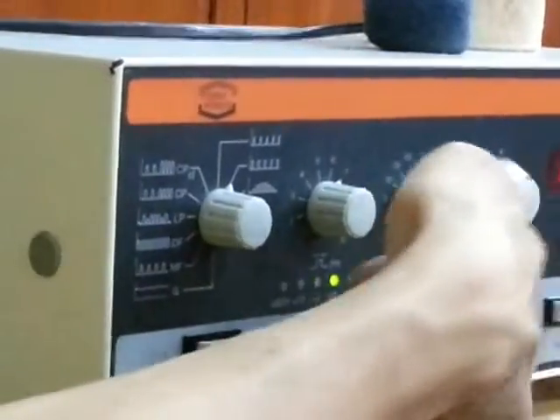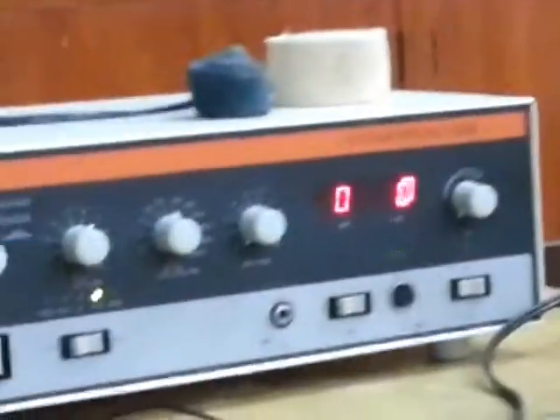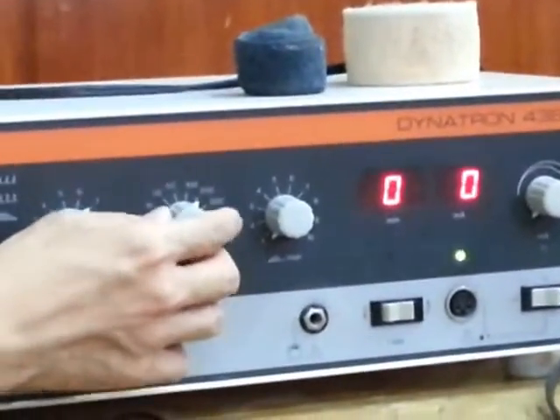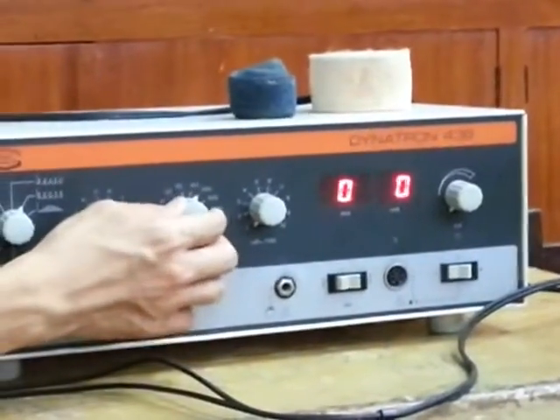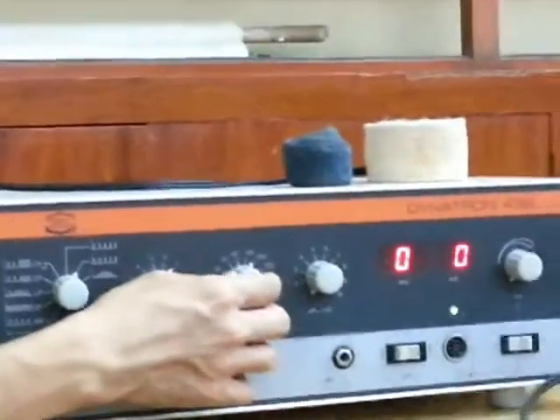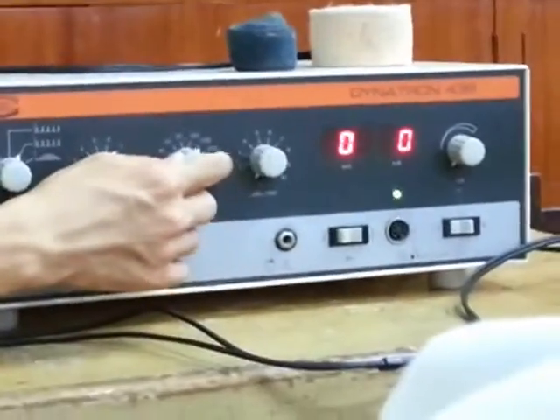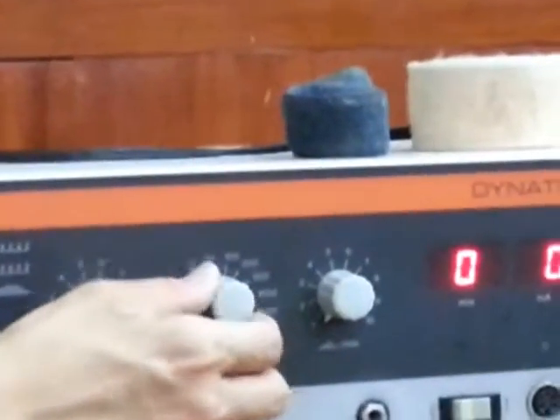If the pulse duration is 70 milliseconds, the pulse interval is times 2 to 3, so either 140 or 210 you can use. Or you can go even greater than 2 to 3 times. It means at least 2 to 3 times the pulse duration, but you can have greater than that.